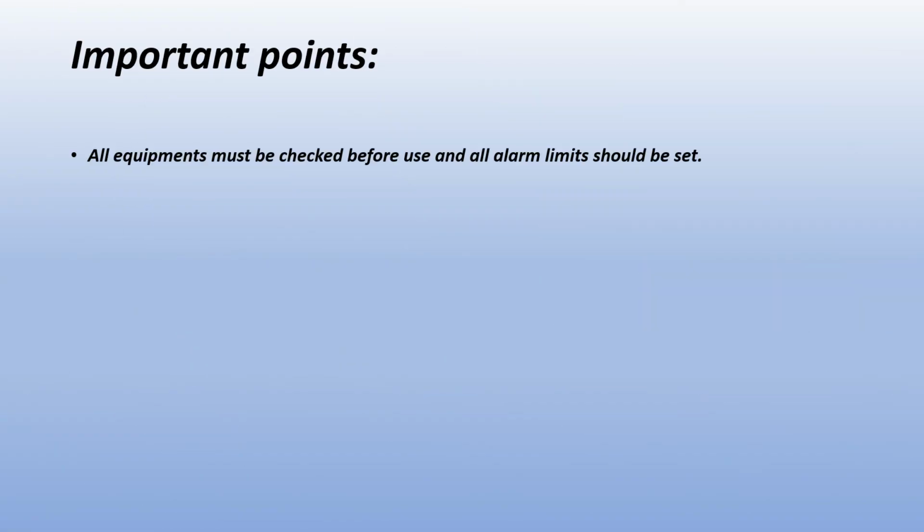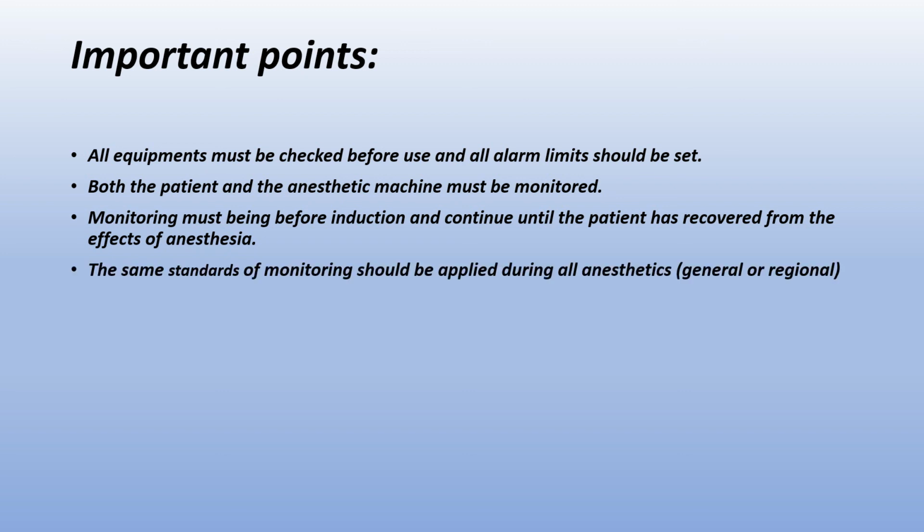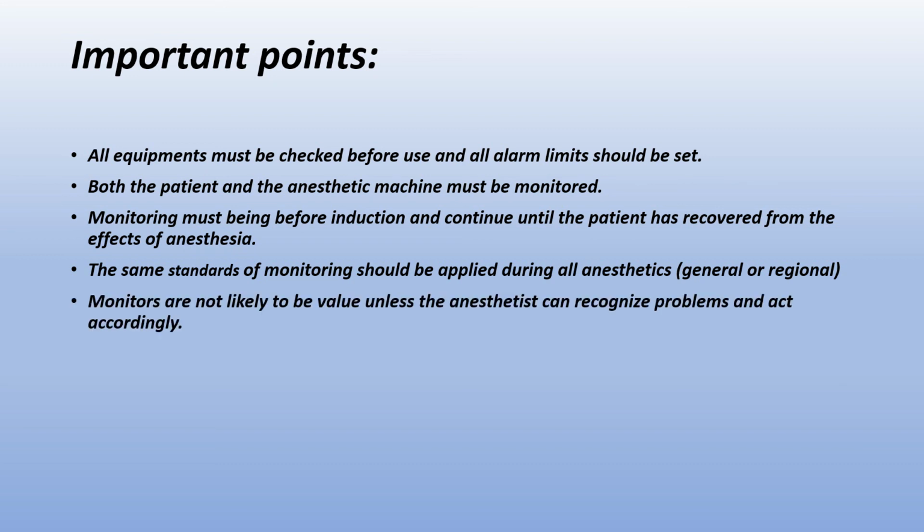Important points. All equipment must be checked before use and all alarm limits should be set. Both the patient and the anesthetic machine must be monitored. Monitoring must begin before induction and continue until the patient has recovered from the effect of the anesthesia. The same standard of monitoring should be applied during all anesthetics, general or regional.